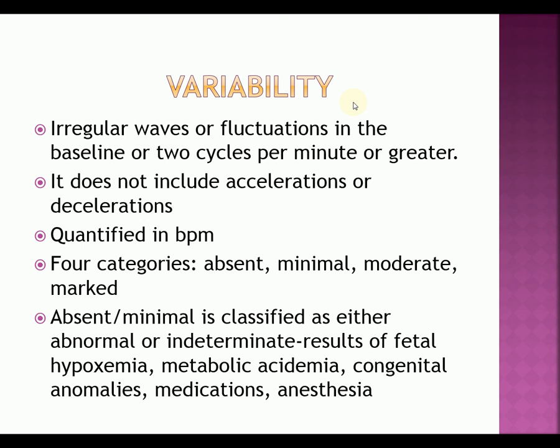Now, a sinusoidal pattern, which I haven't mentioned, a sinusoidal pattern is where you have a wave-like pattern. It's not usually considered part of your variability, but it is a pattern that you need to be aware of, and you should be very reactive to. You should call your doctor if you see a sinusoidal pattern, and there's an example of that in your book.